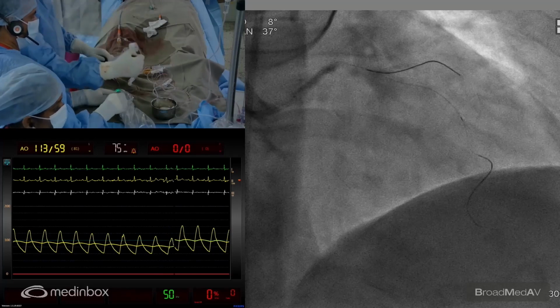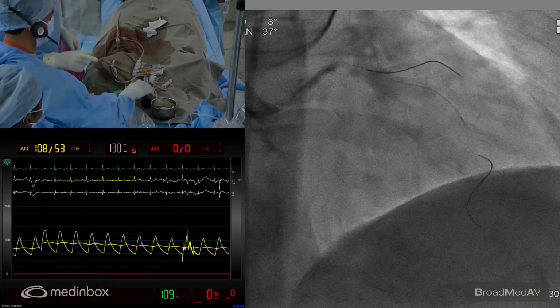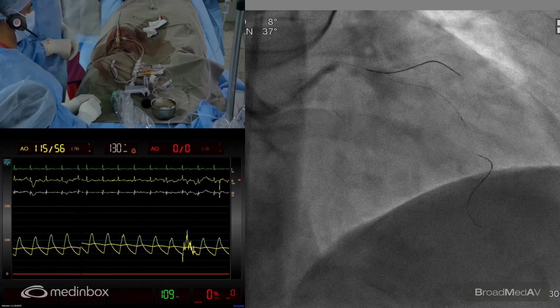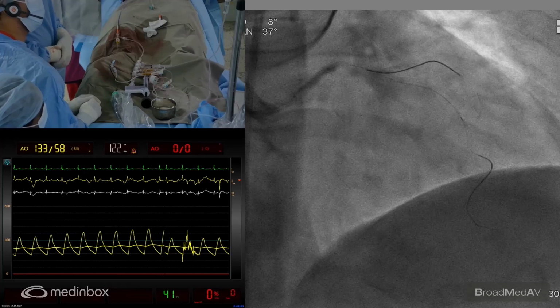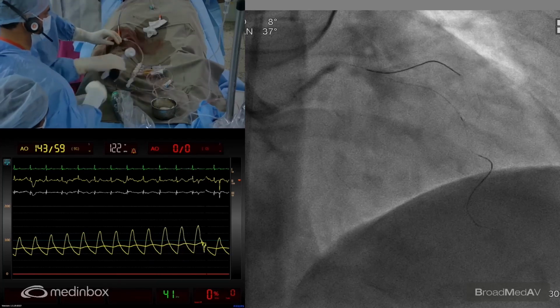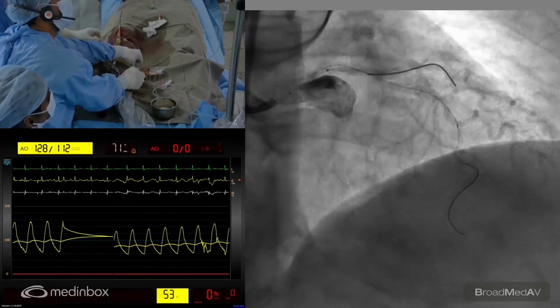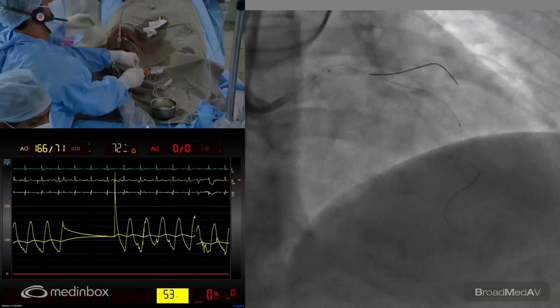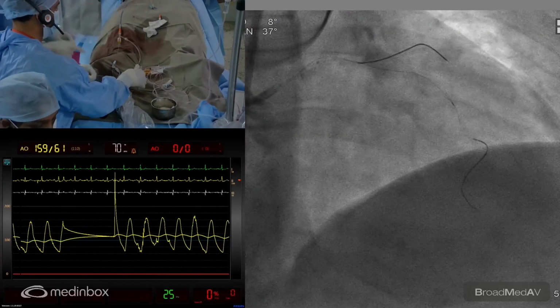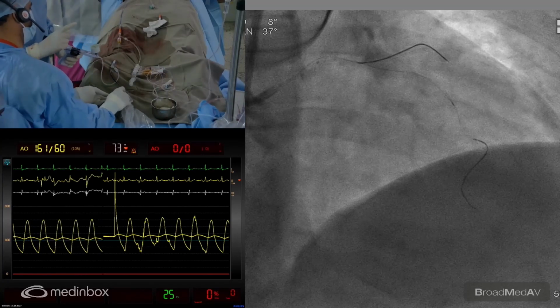Deflate, sir. Okay, so this was done. The first round is over. So let's see how it happens. The next round we'll do the full 10, please, because let's hope that he can tolerate the pressure as well. Okay, let's take a small shot here. Okay, shall we take an IVUS and then? Yeah, I think we should do all the few shots and then go ahead. So let's go ahead with one more round of the whole thing.